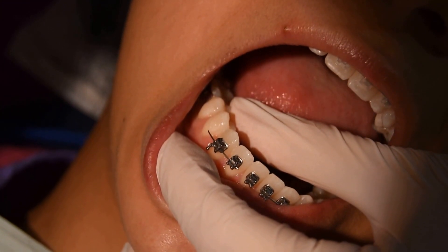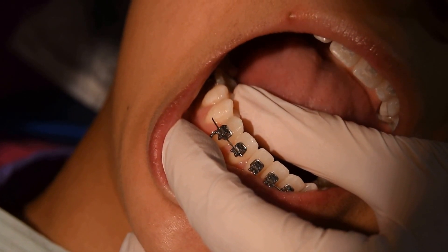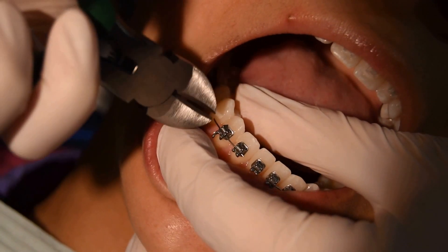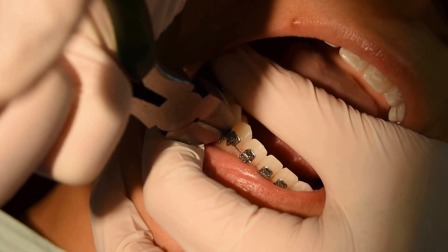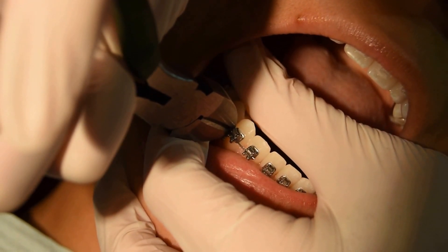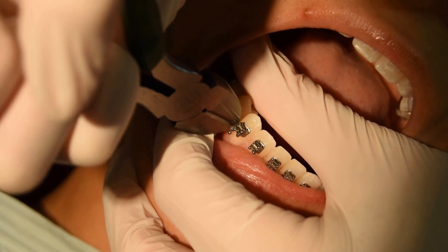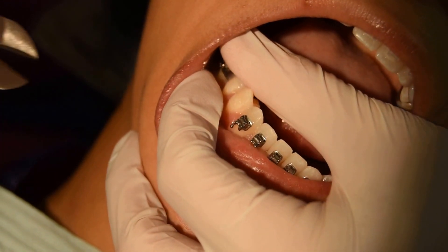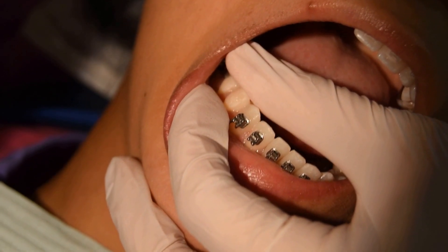This is an example of using the wire cutter. So if you have a wire poking out, just simply take the wire snipper and go right as close as you can to the next bracket where it's attached. Try and keep your finger behind it so that you can catch it, and then just remove the loose piece and put a little wax over that area — and good as new.